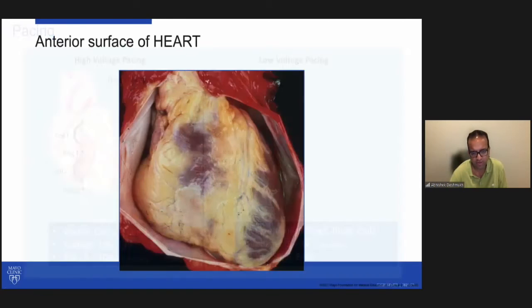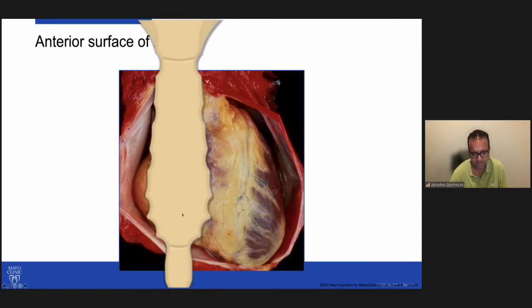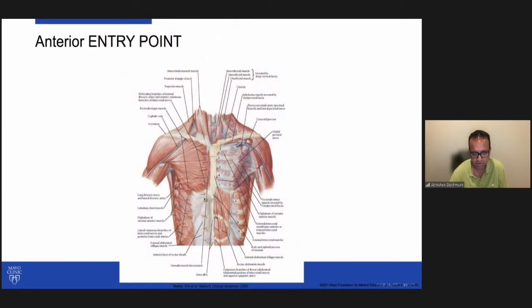Now, when we think of implanting it, we need to understand some anatomical aspects and some anticipated challenges. So this is the anterior surface of the heart: right ventricular outflow tract, right ventricle, left ventricle. These devices go behind the sternum, but not towards the heart. So as we get prepared for implanting these devices, some regional anatomy is very, very important to know. One key part is that if you are going to get access here, there is a diaphragm which would need to be crossed as we get here.